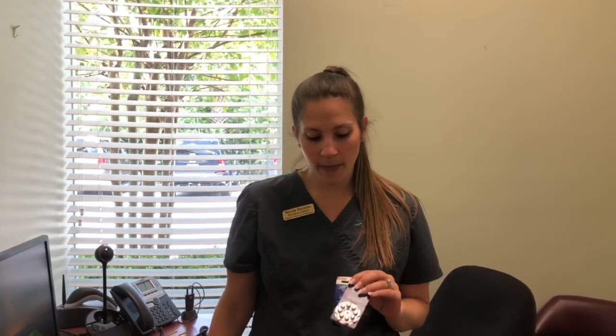Make sure to remember to be brushing your hearing devices every single night, and you can pick up your toothbrush at our office or at your next appointment. And also make sure to remember to grab your hearing aid supplies, either batteries or these wax filters, either at your next appointment or whenever you want to stop by our office.